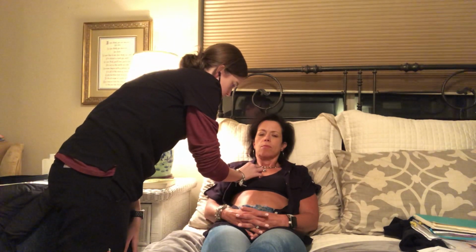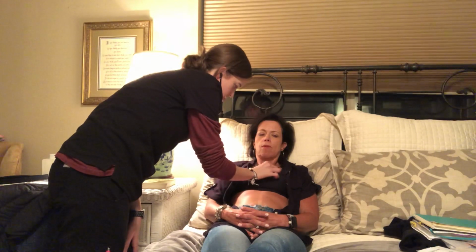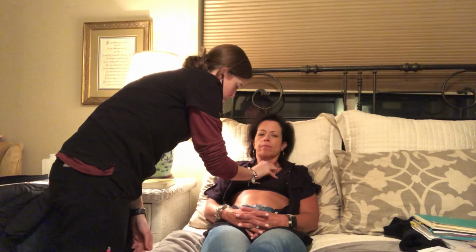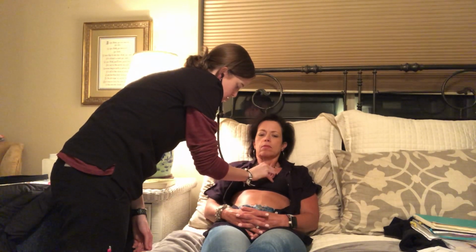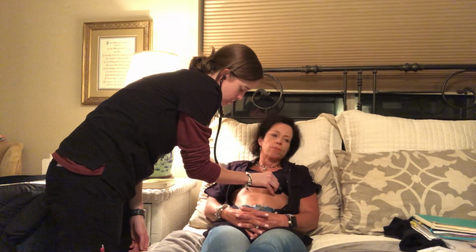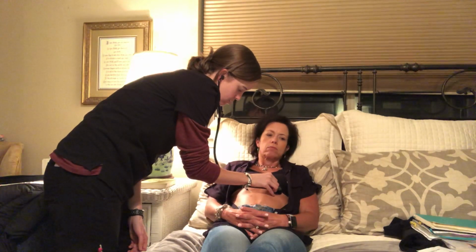So we're listening to the aortic area, the pulmonic area, Erb's point again, and the mitral area.